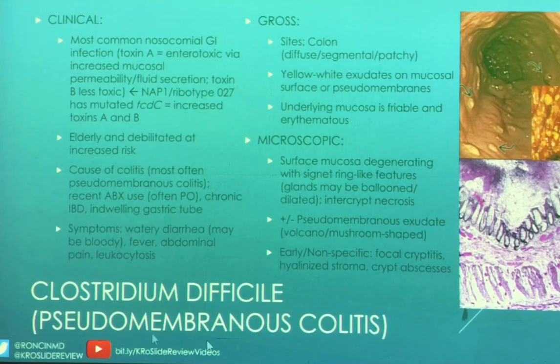So this is pseudomembranous colitis, and pseudomembranous colitis is very commonly associated with Clostridium difficile, and some of the features that we saw could be attributed to Clostridium difficile. So I'm by no means saying that this is definite Clostridium difficile infection, but it's the most likely thing just based off of a single slide.